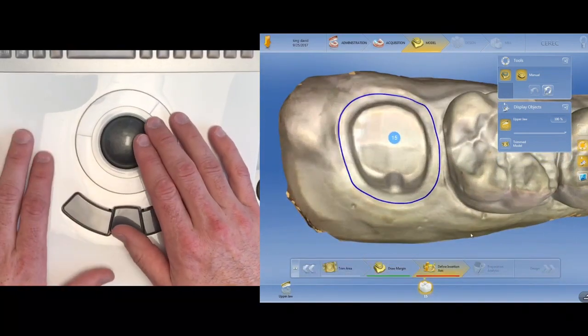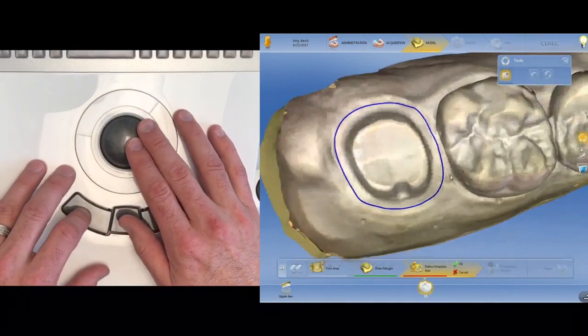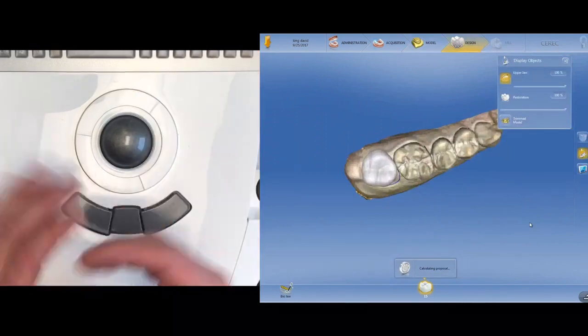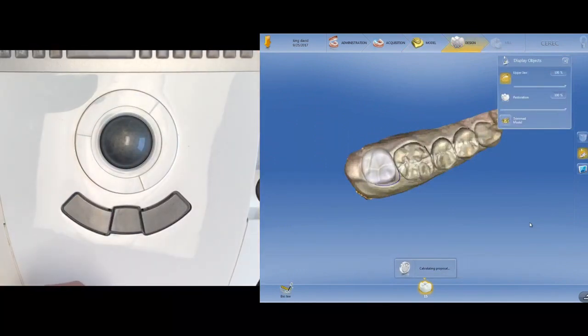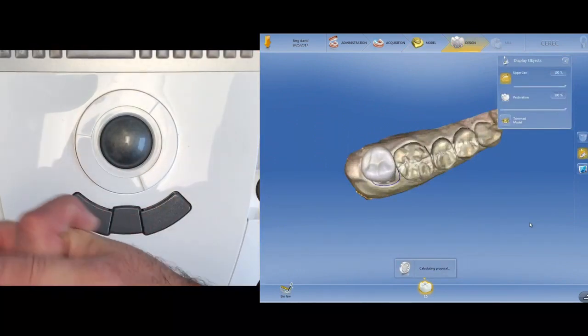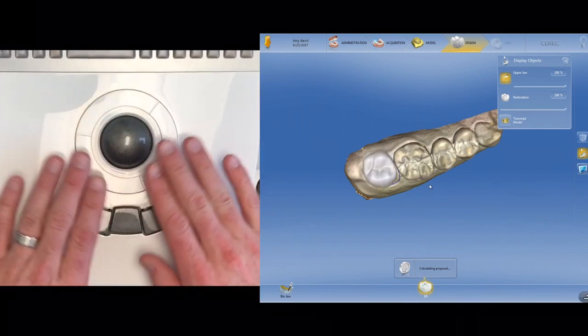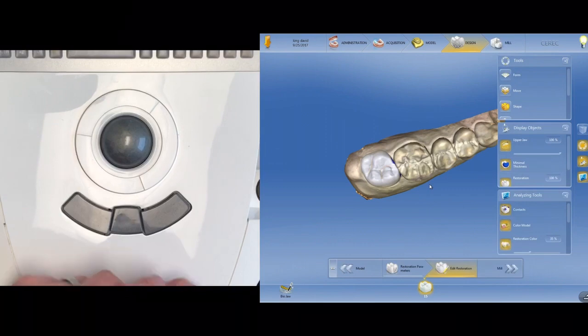Then I'm going to hit define insertion axis. We've been through this before. I'm going to just glaze through this real fast. Now we get to the design phase, so it'll design my restoration. And then I just want to demonstrate one more thing with the buttons, and then we'll end this video.